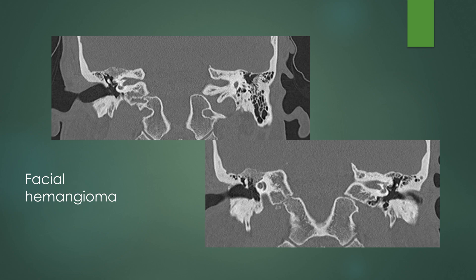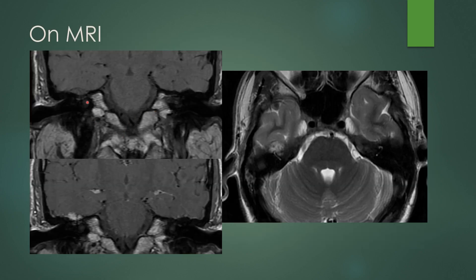You can have a lesion referred to as a facial or cavernous hemangioma, found at the superior aspect of the temporal bone at the mastoid portion. This is a honeycomb appearance of an expansile lesion above the level of the cochlea and IAC. Here's the lesion on T1 pre-contrast; it enhances post-contrast because it is a vascularized lesion. Sometimes you can see it on axial T2 — it has a bubbly, round appearance. This is a facial hemangioma or cavernous hemangioma.